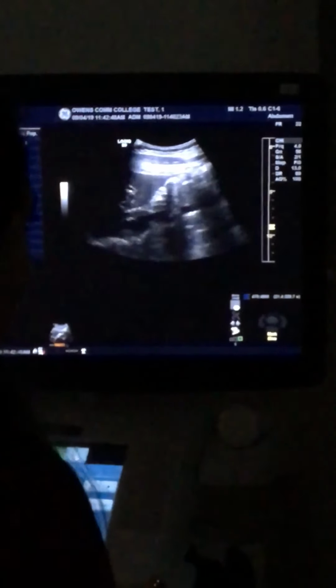All right, so then I start long. I do want to preface this by saying the way your guys' liver protocol is set up is not going to be how you see it done all the time. Liver is one of the ones where you'll see it done differently a lot, and it's to sonographer preference. And it's not that it's different images, it's just the order in which we get them is different.